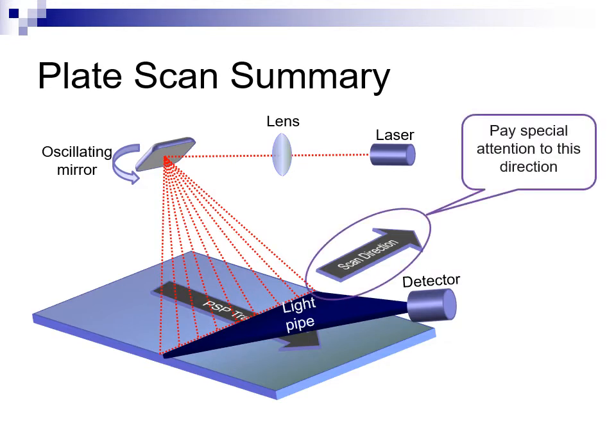I've added two arrows to the image that depict the PSP plate's travel direction and the laser scan direction. It is important to know the scan direction of a particular size of cassette. If on grid images you end up with moire artifacts, knowing the scan direction can aid in the diagnosis of the problem. Refer to my presentation on grid frequency for more information regarding moire artifacts.